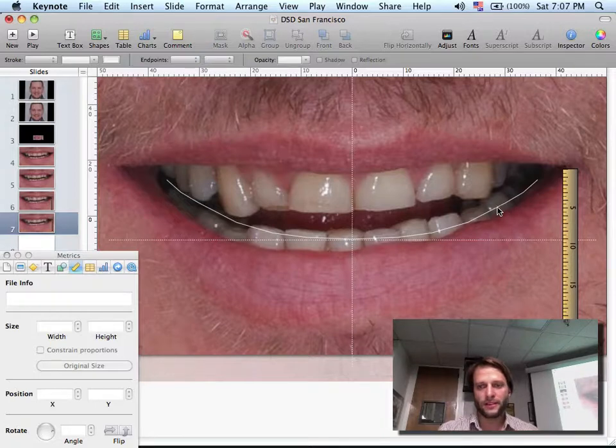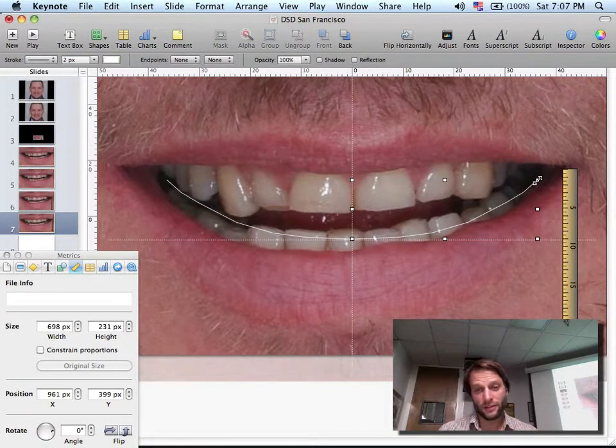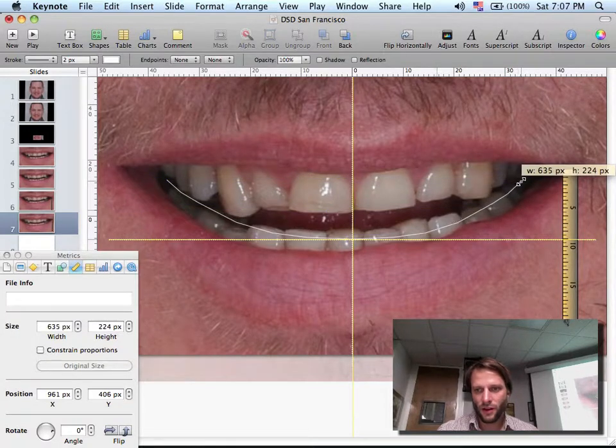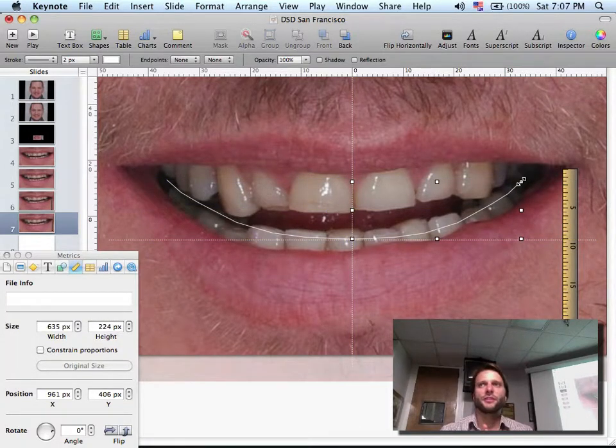So I will adapt. That's the first time we're going to adapt, actually the second time, because first we adapted the midline to a point that I believe is reasonable. This is actually what we will do when we are analyzing and adjusting a provisional. What do we do when we fit the full upper provisional in the patient's mouth? We ask them to stand up and smile at us. And what we're going to do is exactly what we're going to do here.